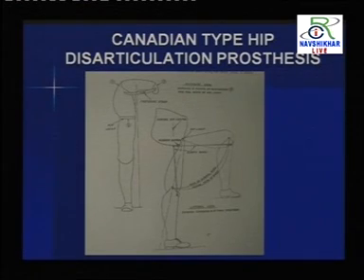The components are made out of wood. कंपोनेंट्स लकड़ी के थे, लेकिन the function was quite good, and the same satisfactory function the patient used to get. Only thing, the weight of the prosthesis was a little more, थोड़ा ज़्यादा हो जाता था. The work for the prosthetist was also more, because for each component they had to spend a lot of time making it, and everything has to be done.